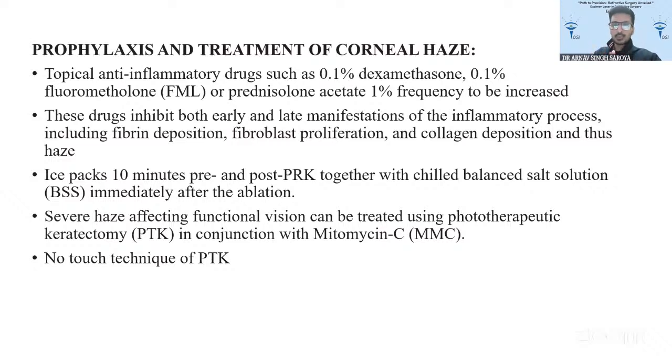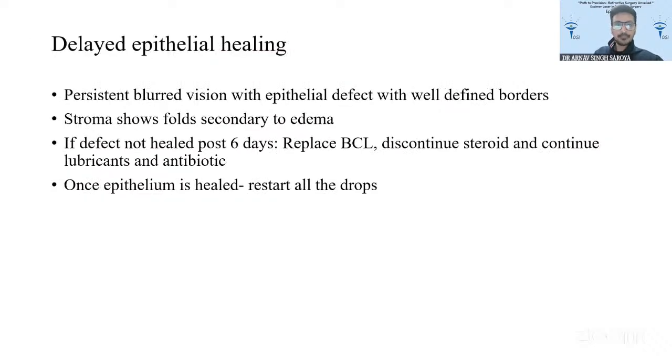These are used to inhibit both late and early manifestations of the inflammatory process. Also, like ma'am told, ice packs 10 minutes pre and post PRK together with chilled BSS solution. Also, use of chilled BCLs helps to decrease corneal haze and pain pre, intra, and post op surgery.